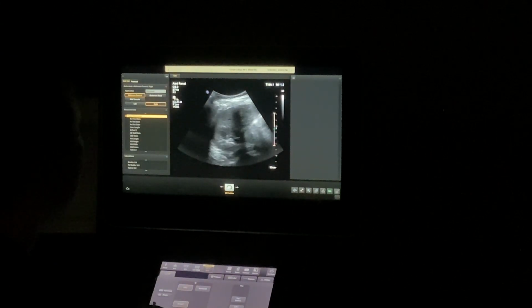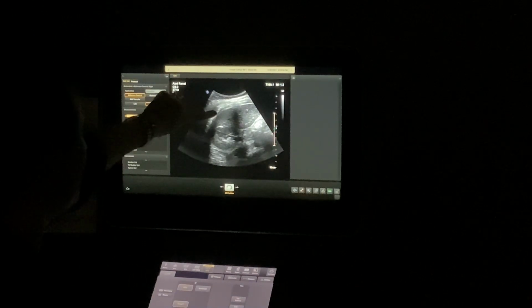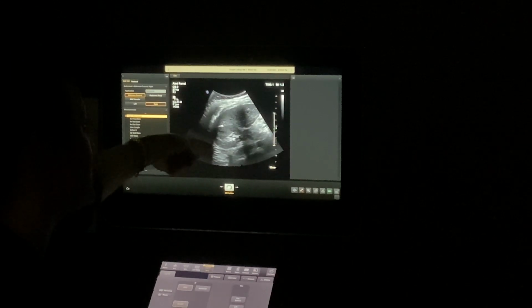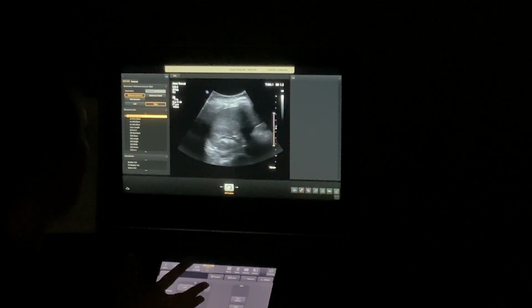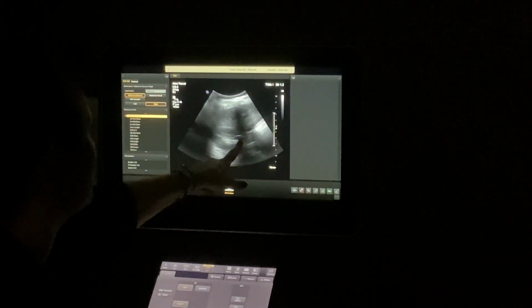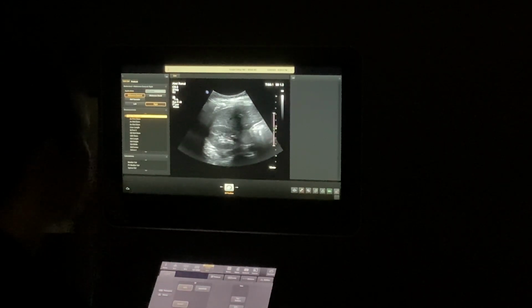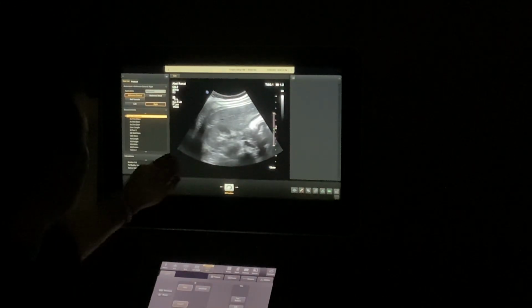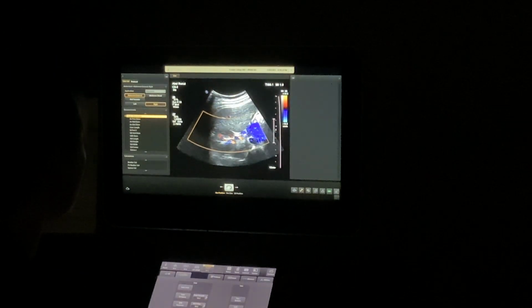All right, half a breath in. So here with her taking half a breath, this shadow coming off the edge of the liver is preventing me from seeing that edge. If I cannot get around that, this is where you'll take multiple pictures, okay? So I can take one showing me the edge, one showing me this other edge here, if I need to. Now breathe. Take a deep breath. Okay. See here how I avoided that shadow by changing my position? Much clearer margins.